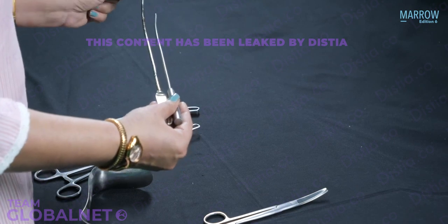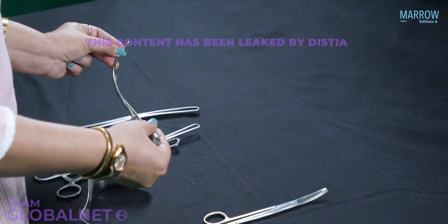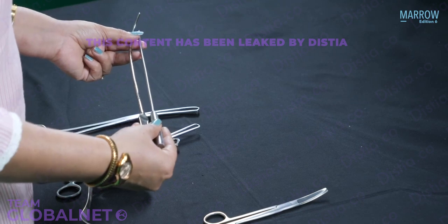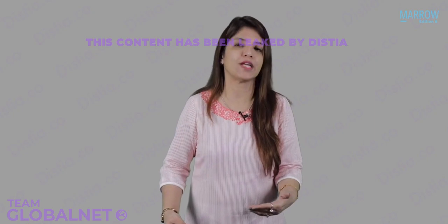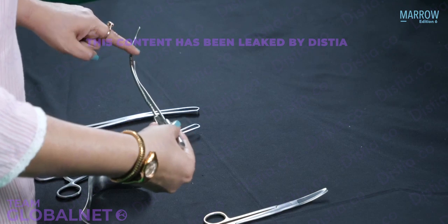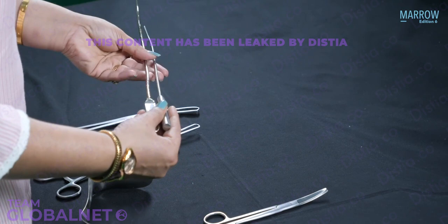Number two, in a uterine sound, look at the tip. Can you look at the tip? This is olive tipped, whereas the tip of the bladder sound is not an olive tip. And the third and the most important way in which you can differentiate between a uterine sound and a bladder sound is that a uterine sound has markings. It is calibrated, right? Whereas a bladder sound doesn't have any markings.